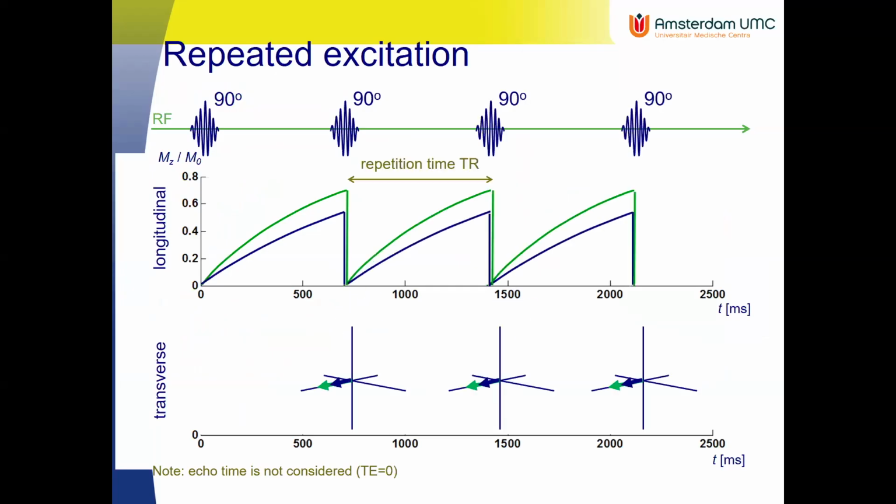And then we're going to repeat that, and the repetition time, TR, is the time between the RF excitations. And it actually turns out to be useful, because to create the full image, we need to repetitively sample and measure the signal. I'm going to tell you a little bit more about that on Wednesday in the lecture. But it does have a useful purpose to repeat the signal and measure it over and over again to build up that MR image.